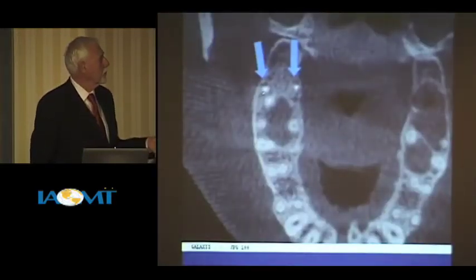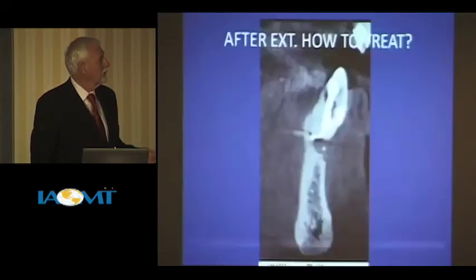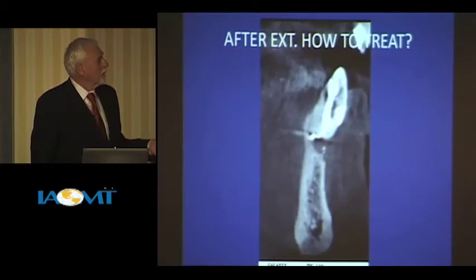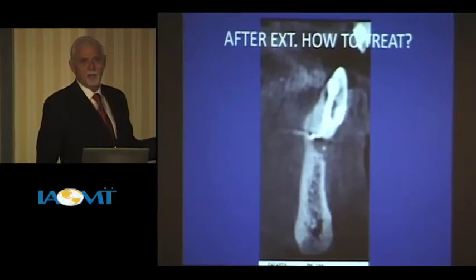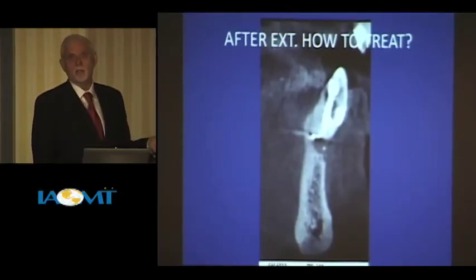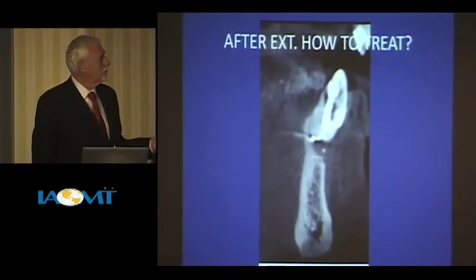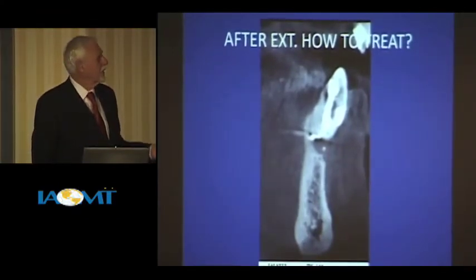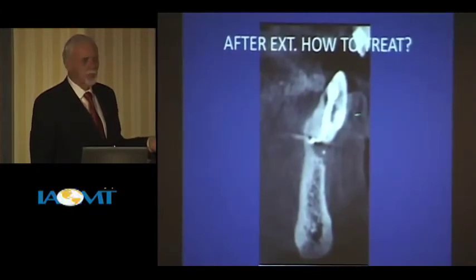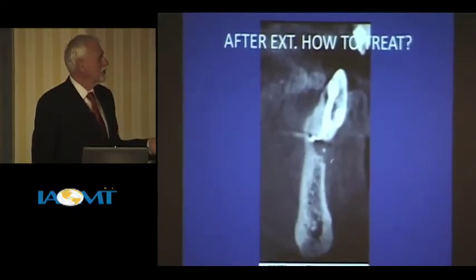Okay, here she is here. See the radiolucencies around those from an apical view? Same thing here. All right, this is a patient I think I saw last week. I could pull up every single patient I have. That's not true. 90% of the patients, I could show you something interesting on the CAT scan. So I don't even think a traditional dentist would think that you want to keep this. But it's real clear from the very beginning when you look at a cross-sectional view, it now lets you decide, okay, I've got some problems. We're going to take this tooth out.